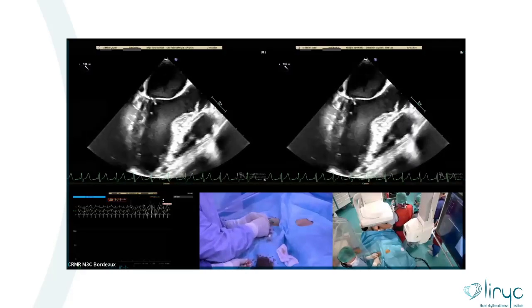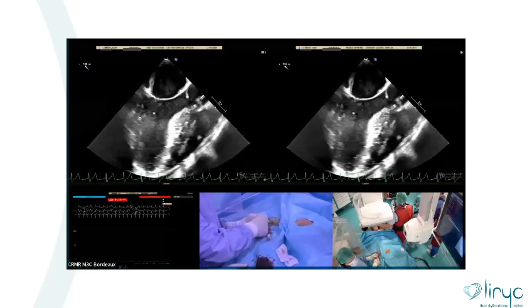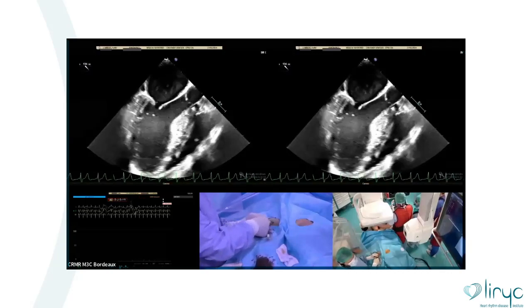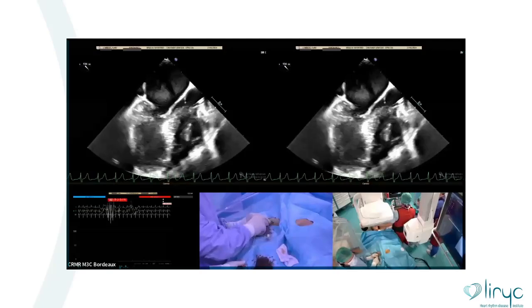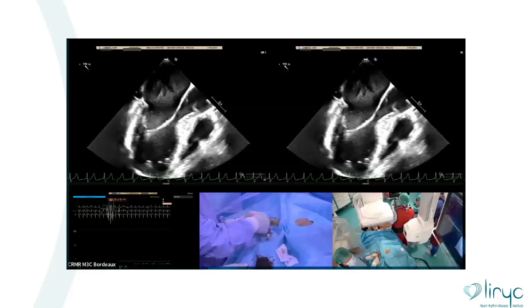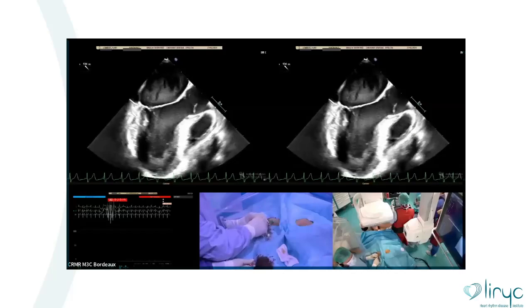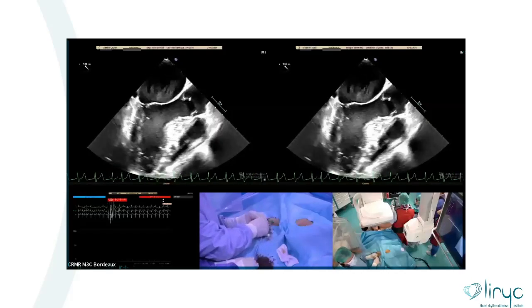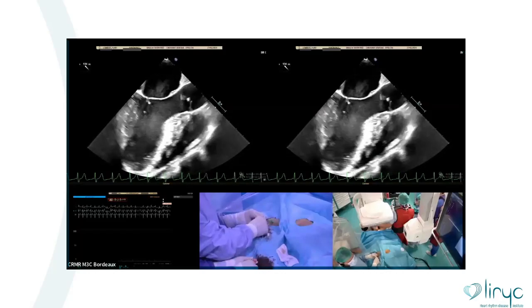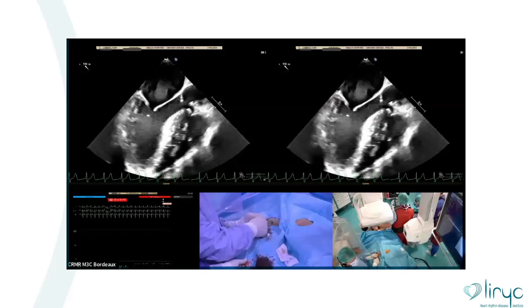Okay. No, rotation, put back and rotation. You can go directly. Okay, good. Go ahead. Okay, go ahead. Still ascending aorta, in contact with the valve.